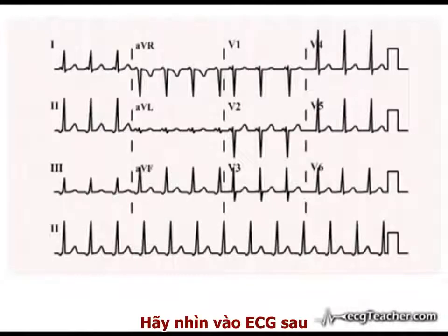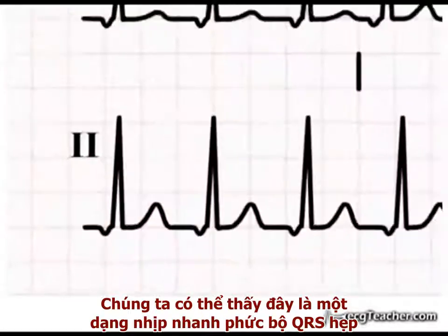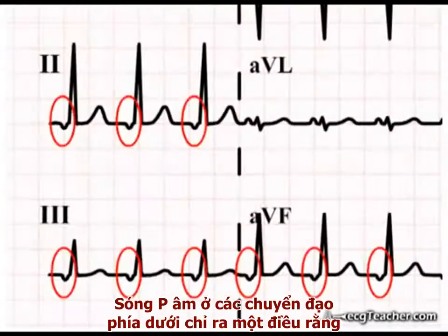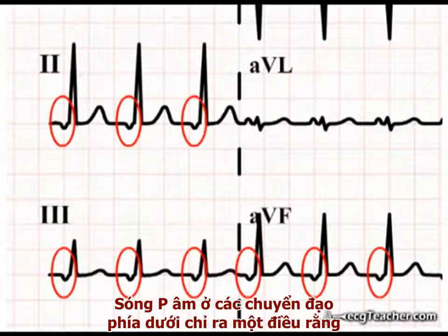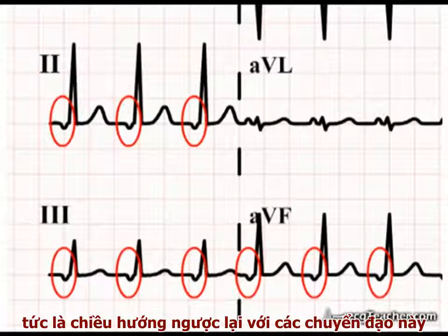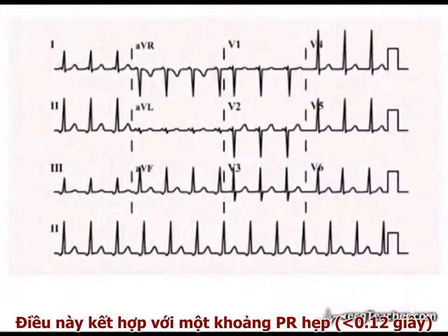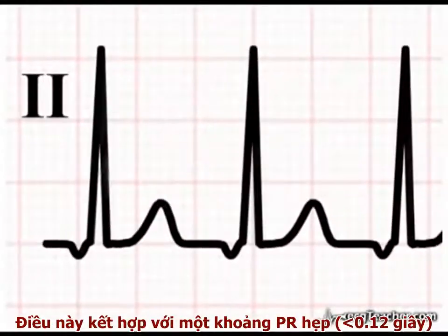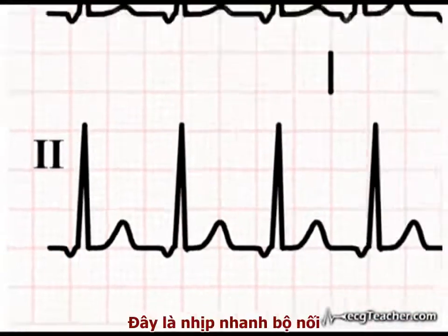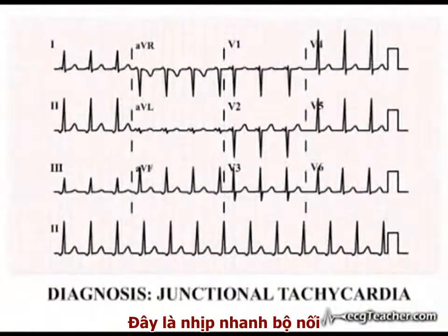Looking at this ECG, we identify a narrow complex tachycardia with a rate of 115 beats per minute. Negative P waves in the inferior leads indicate that the P wave axis is travelling superiorly, away from these leads. This, combined with an abnormally short PR interval, places the source of the depolarising discharge in the junctional region. This is a junctional tachycardia.